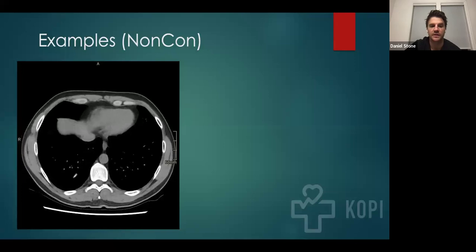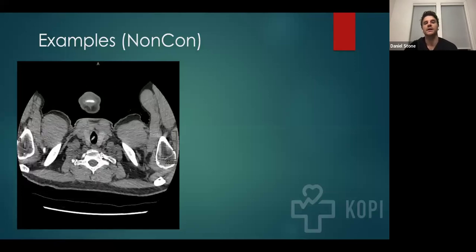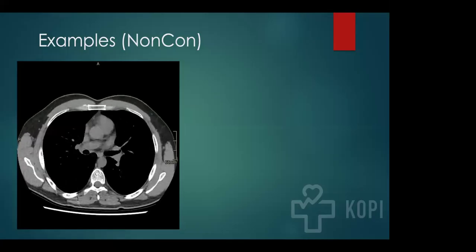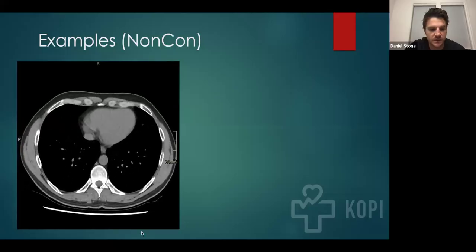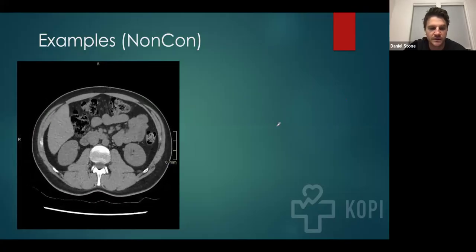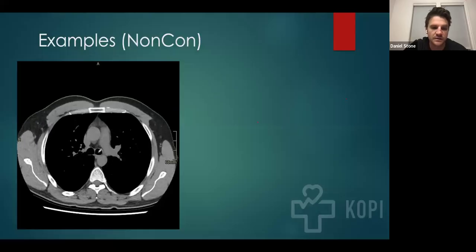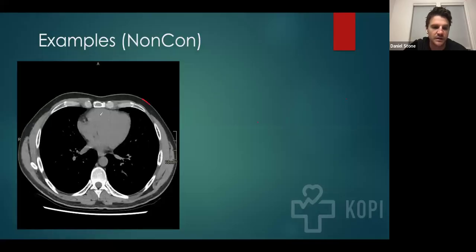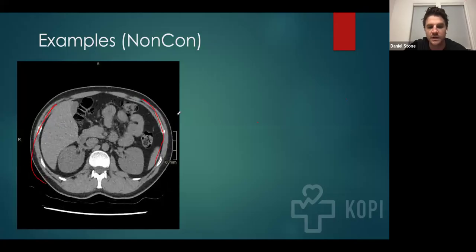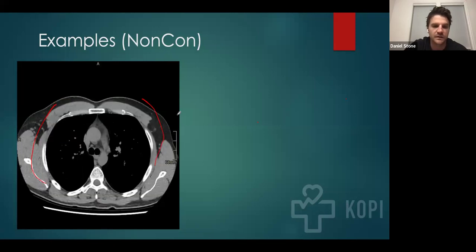None of the pulmonary arteries are lighting up, so you can't discern what's lymph tissue, what's soft tissue, or what are blood vessels in this. That's part of the limitation of a non-con, but you can still see the actual lung fields pretty well. And you can see them quite well comparatively to a chest x-ray. So this is why a CT is helpful in evaluating the lung field.